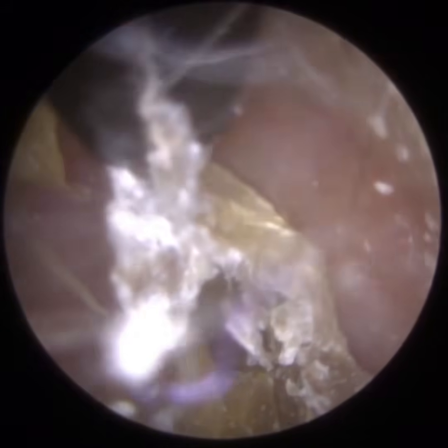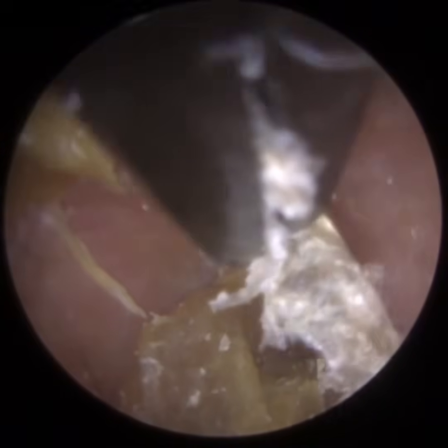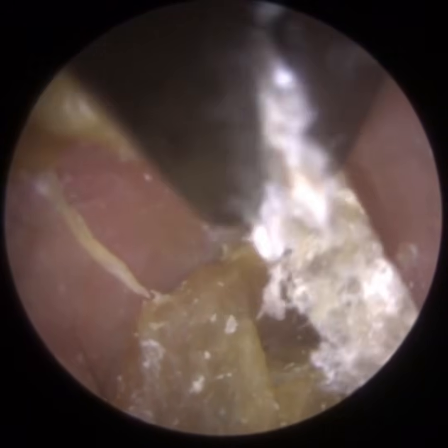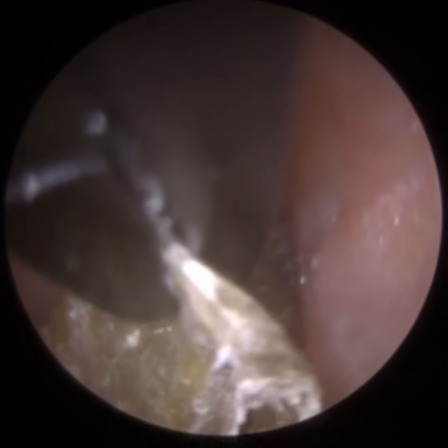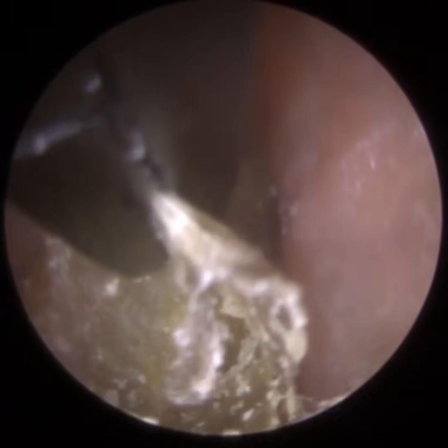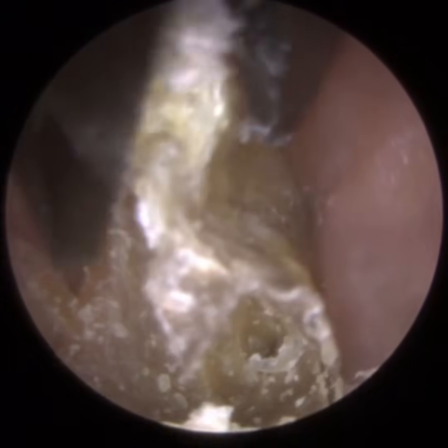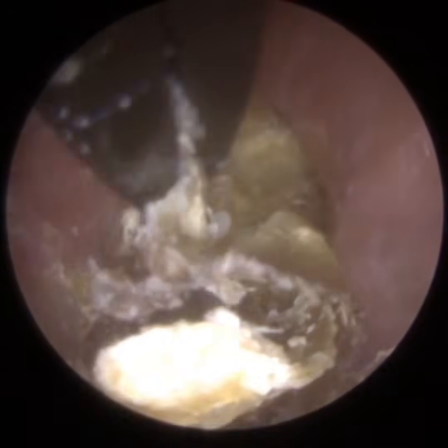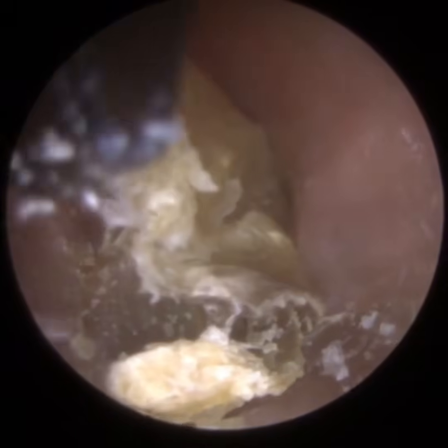So I'm just going back in, maneuvering the forceps forwards, from right to left, trying to move it away from the posterior canal wall. Just in the distance now, you can see it's strongly adhered to the eardrum. I'm just pulling the skin downwards now from top to bottom, just to again loosen it off the ear canal. I believe this time I'm going to get a good grip, and I'm going to gently wiggle this skin forwards, left and right, so it comes off the eardrum and out of the ear.